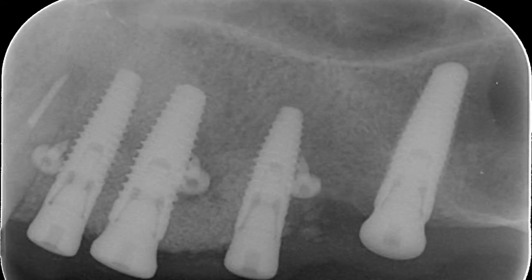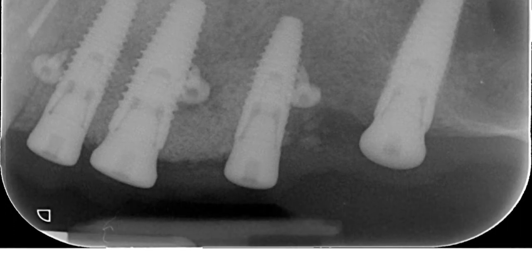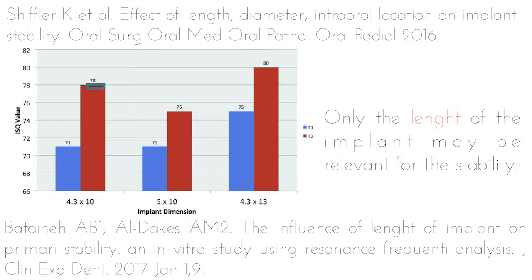And then I did extra boosting to get the buccal bone balcony. Now you can see that all the 4 implants are placed within augmented bone, all of them, except for the mesial, which is placed in contact with native bone on the palatal aspect. Which is the best time to load these implants? Really, it's something that we need to figure out.